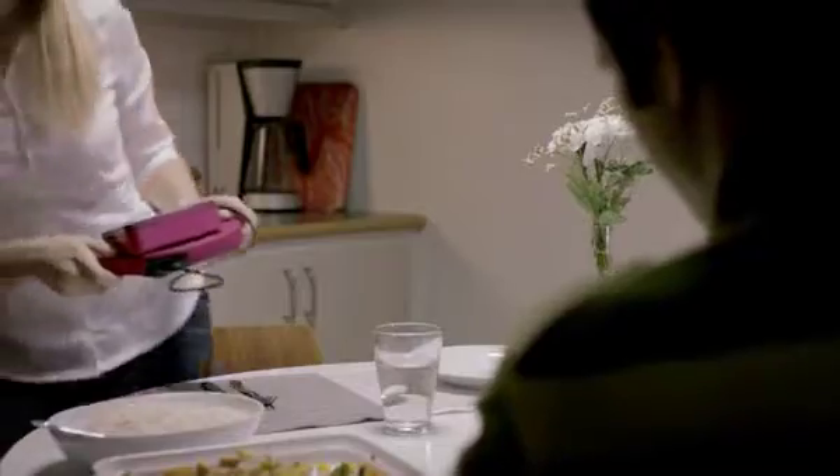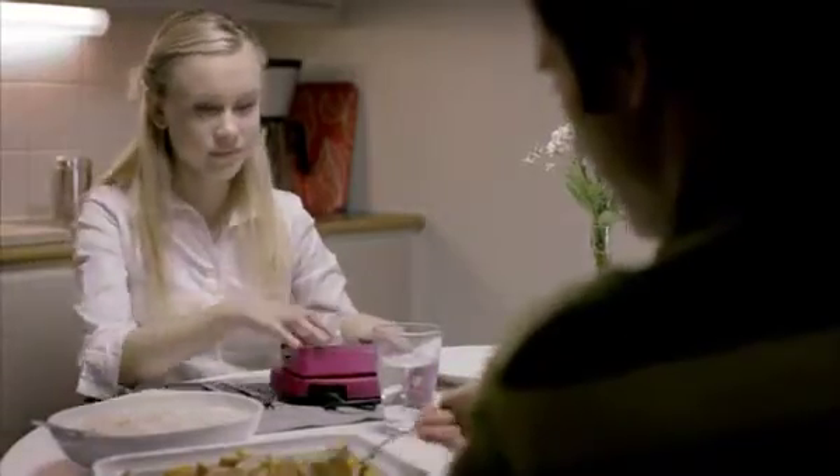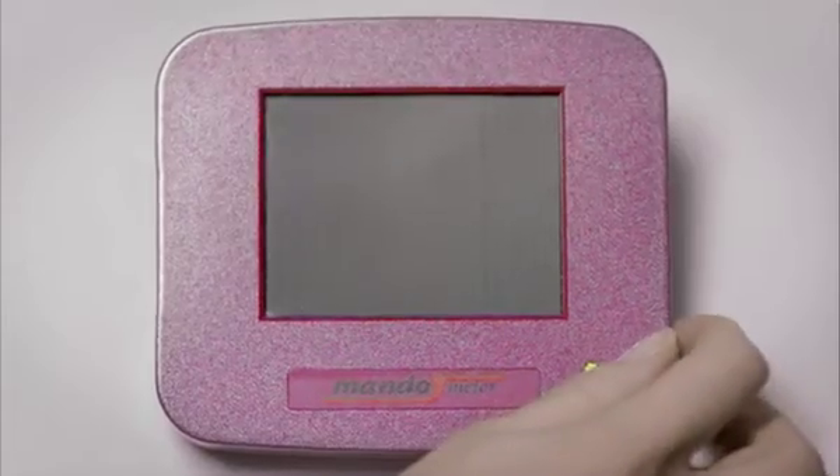Mandometer helps you control your body weight by teaching you how to eat normally and how to feel normal sensations of fullness.